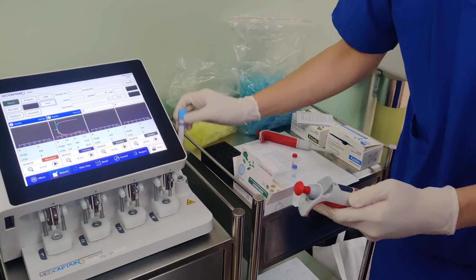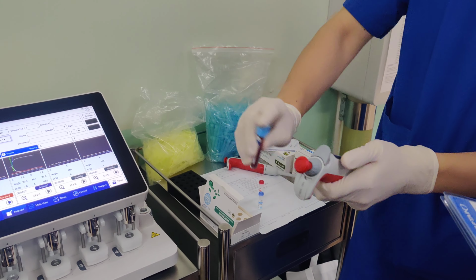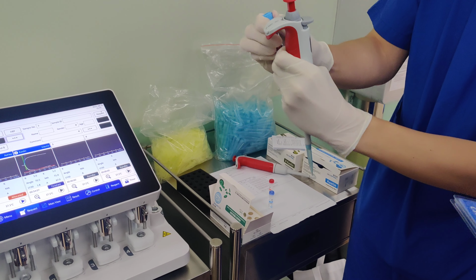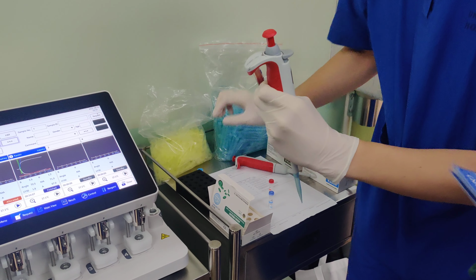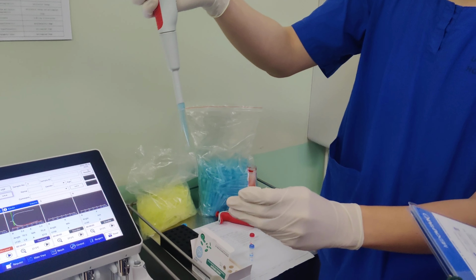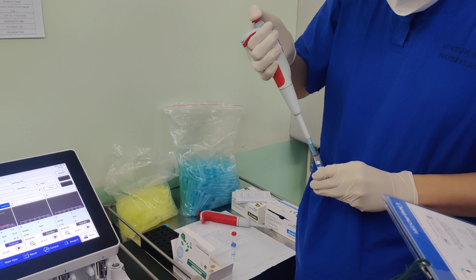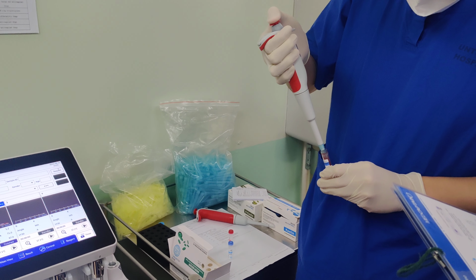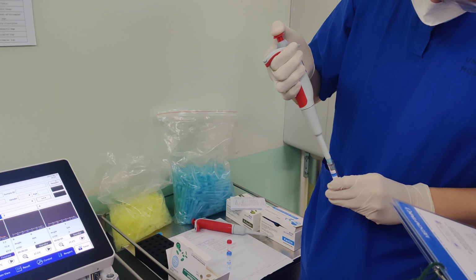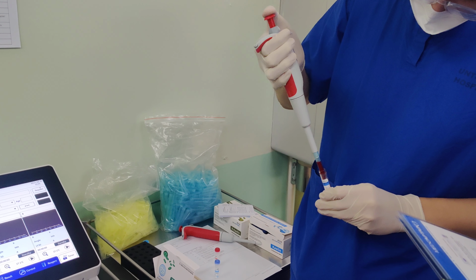All this while the blood has been in the warmer, right? So when we take out, we just mix it up a bit. Open. Okay, same like just now. 1000. First stop. And then you make sure the tip is under there, and you slowly release. So watch my thumb. You slowly release, then it will aspirate 1 ml of blood.